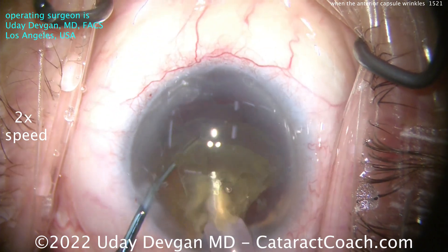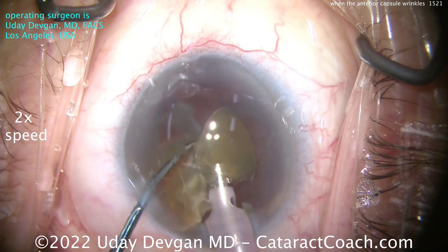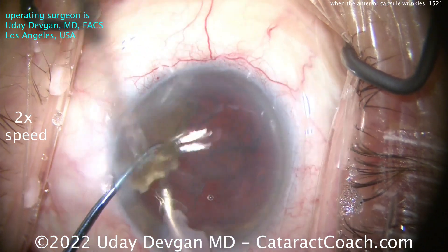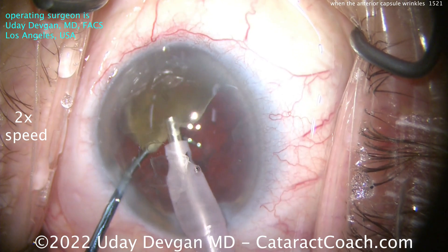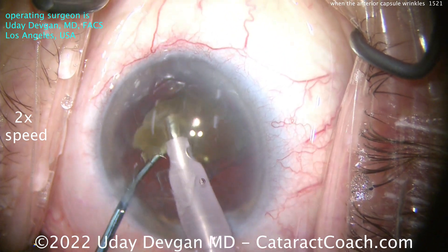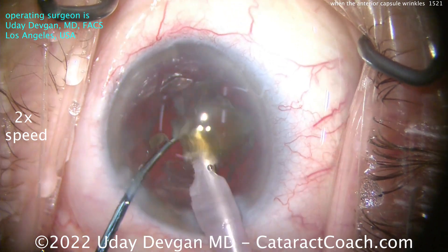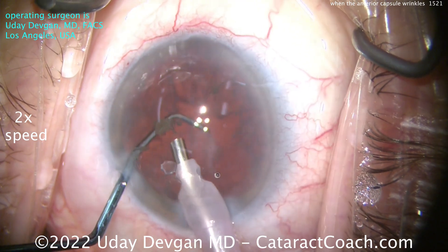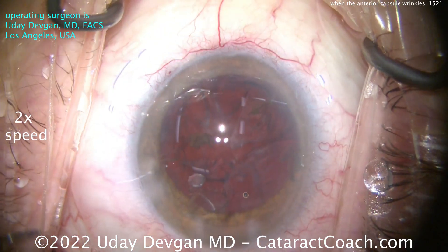Now we're removing the rest of the first half — half the nucleus is gone just about like that. The second half is sitting there underneath the chopper. You can bring it in front, bring it around. If you want to, you can further sub-chop it, or simply emulsify it at the iris plane. I'm not operating up against the endothelium; I'm operating closer to the iris plane. The chopper is in that safe position just to make sure the capsular bag doesn't come forward.